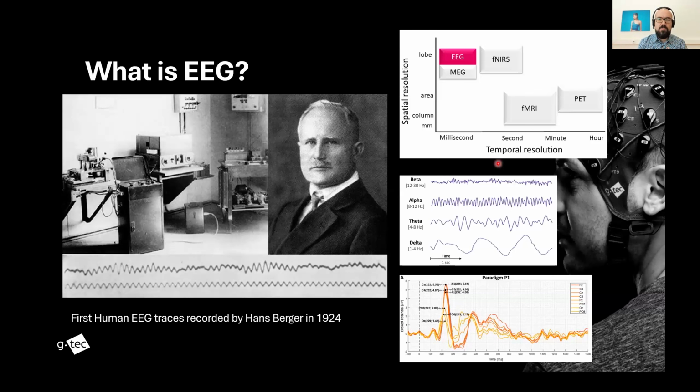This is something that many of the studies, for example, long cognitive studies where you are putting subjects through paradigms that require them to relax, then maybe do some cognitive task, move different parts of the body, use. So you'll be able to discern between different kinds of frequencies which are happening in a short period of time.